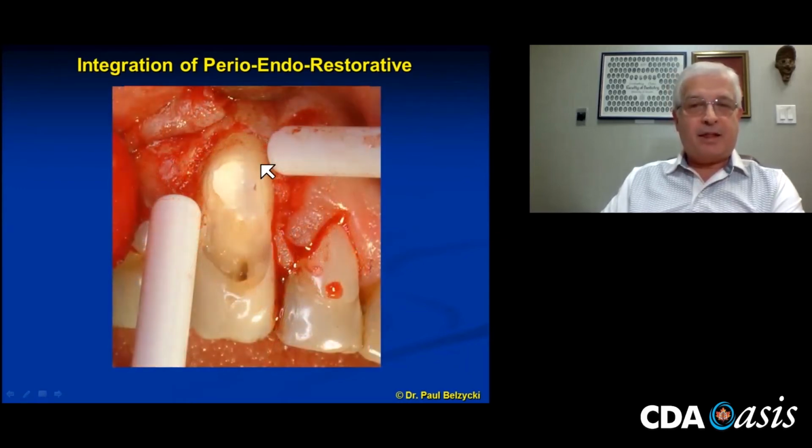Recognizing that I would keep the tooth and I could do the endo, which I would all do in one appointment, I just placed some soft Dycal here, or I may have placed TempBond in this area, just to cover that canal so I could get into it immediately after restoring this tooth.